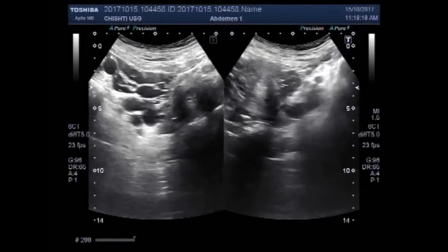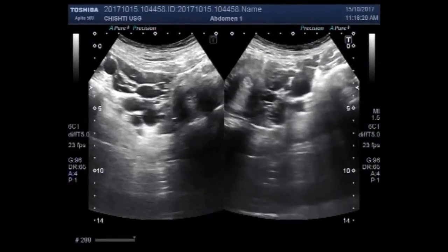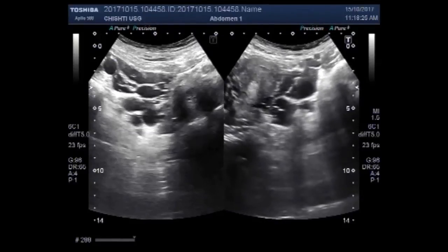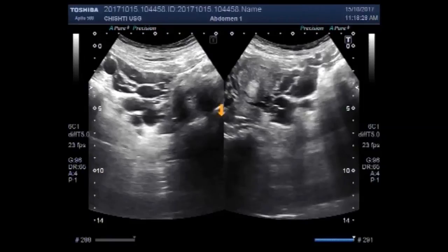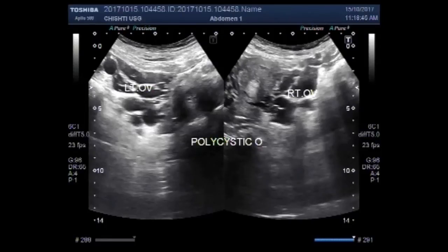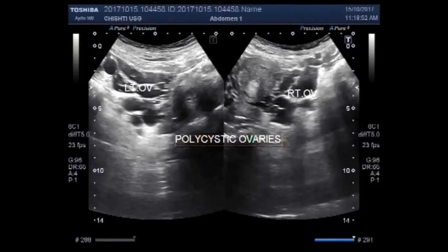This is the right ovary on the right side of the screen and the left ovary on the left side. These are polycystic ovaries — polycystic ovaries on both sides.